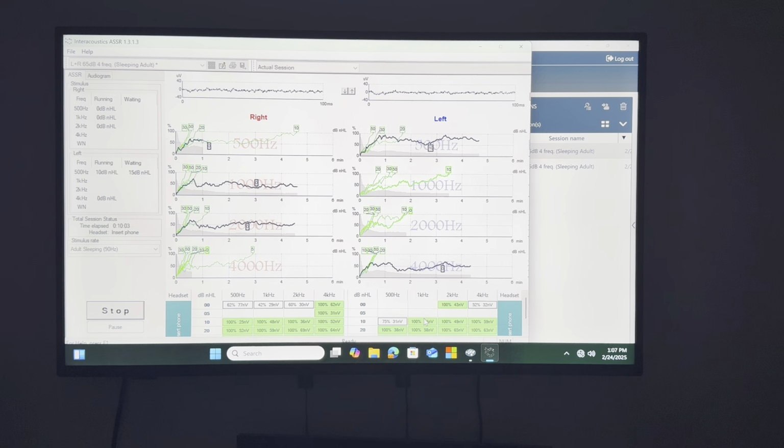If you did that study on normal hearers, would it change for someone with a hearing loss? Yeah, plus with hearing loss you have that recruitment thing and all. You can look at the hearing impairment also. So again, you're looking at what the threshold is using 2 minutes. If it did not reach like 95%, then you increase it.